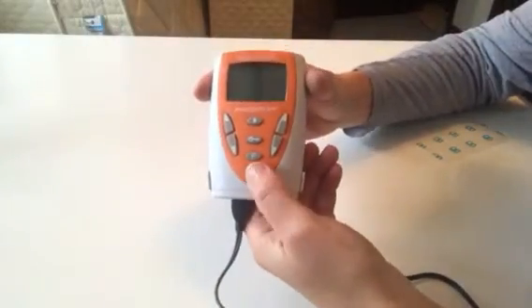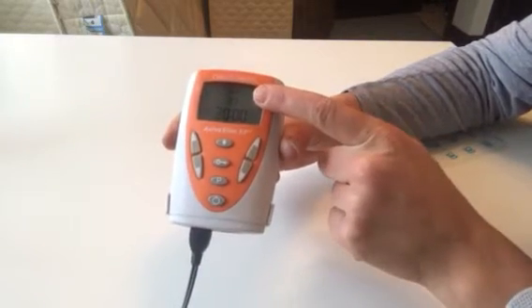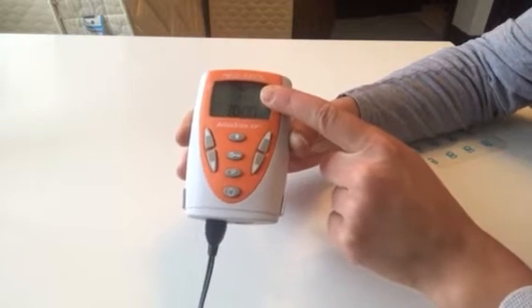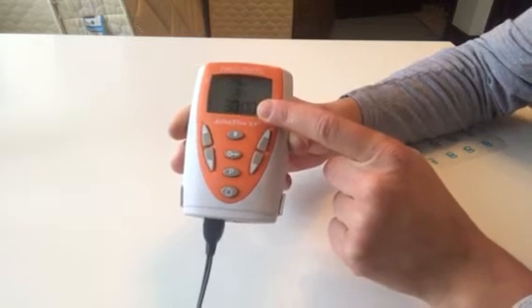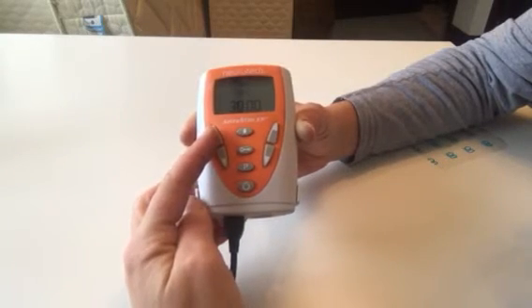With the device, press the power button. It remembers which program you used previously, so program one will cover most of your uses for neurological rehab. The time is already set and the parameters are already pre-programmed into the device, so all I need to do is press the increase intensity button.